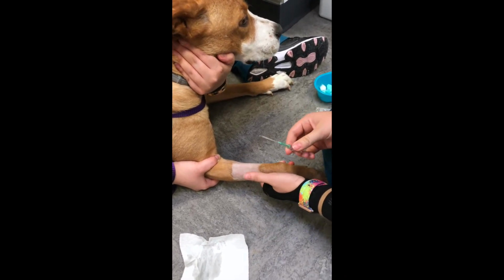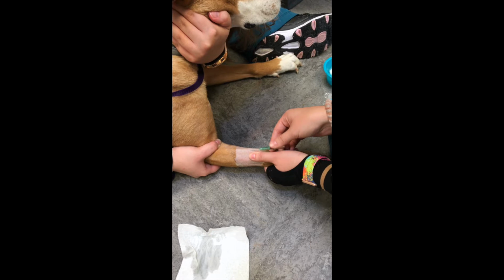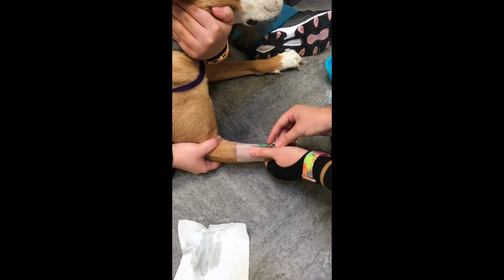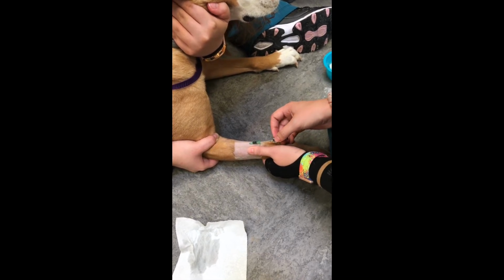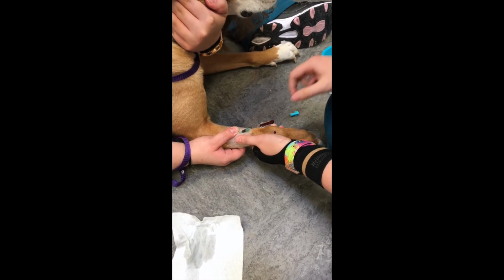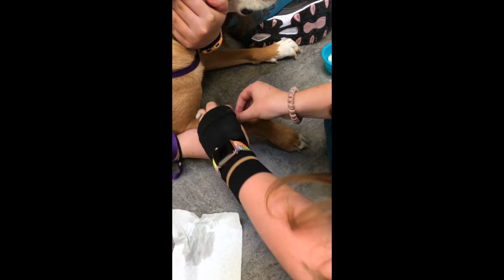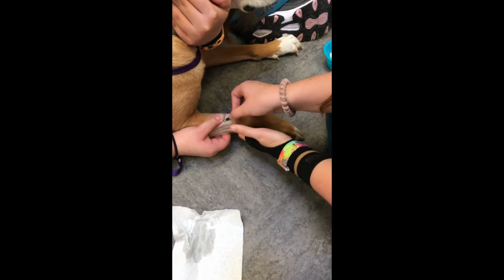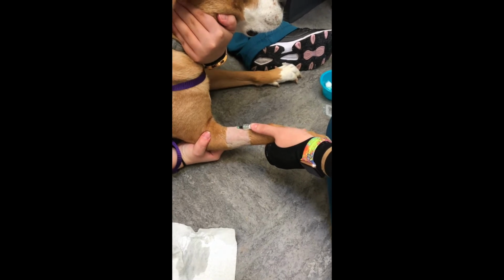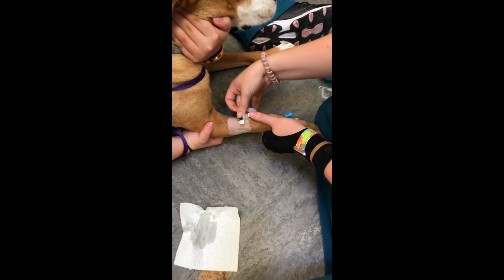With your catheter with the bevel up, insert till you have a flash. We have our cap on. There's a bunch of different ways to tape. Everybody's going to do it a little differently.